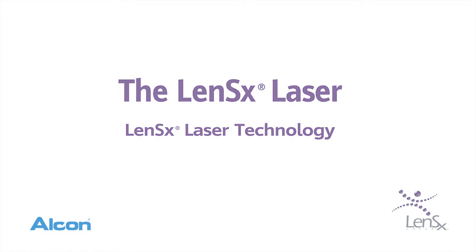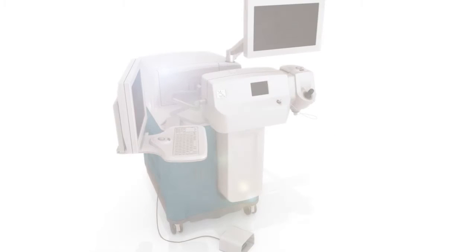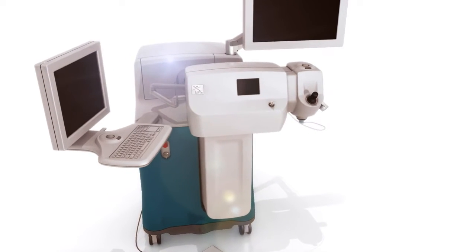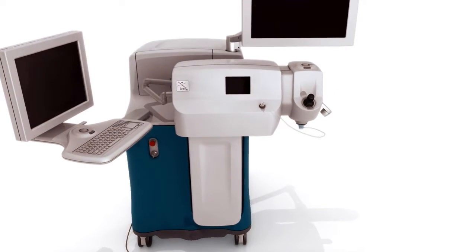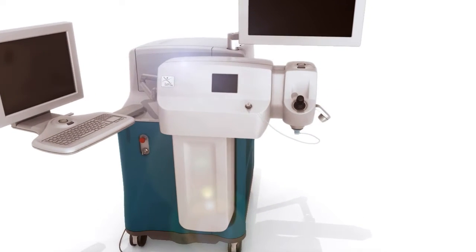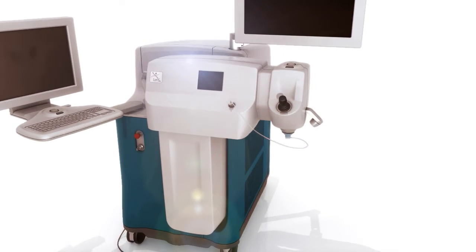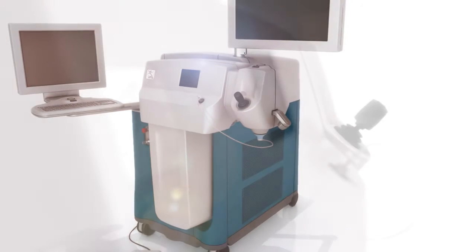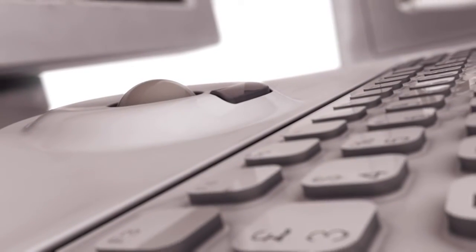The first leap forward in laser refractive cataract surgery, Alcon's LensX laser is putting the future in motion. Delivering the accuracy of a femtosecond laser to refractive cataract surgery.